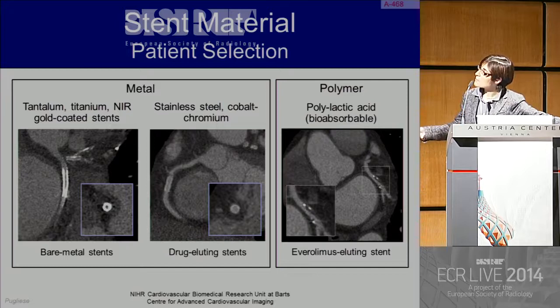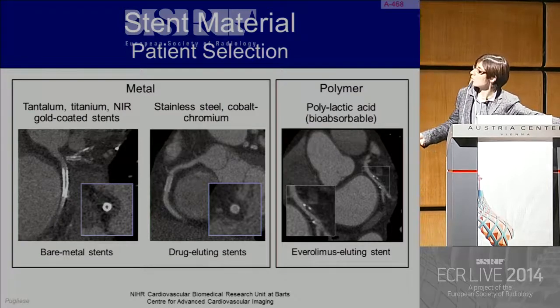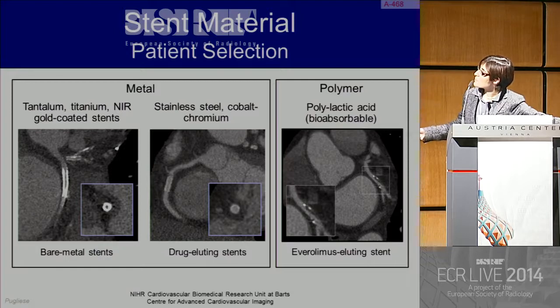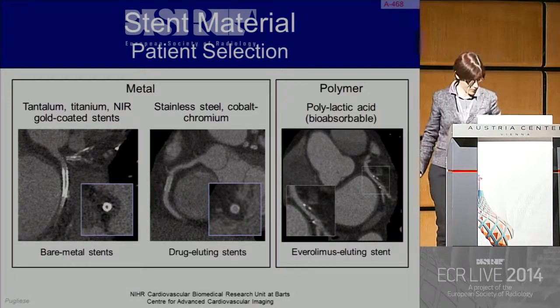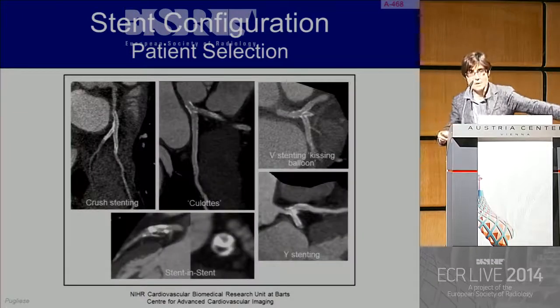I put in, by comparison, a stainless steel stent whose struts are much less dense on the CT image, and also a non-opaque bioabsorbable stent, which does not have opaque struts but just radio-opaque markers at its edges, although these ones are not widely used in clinical practice yet.